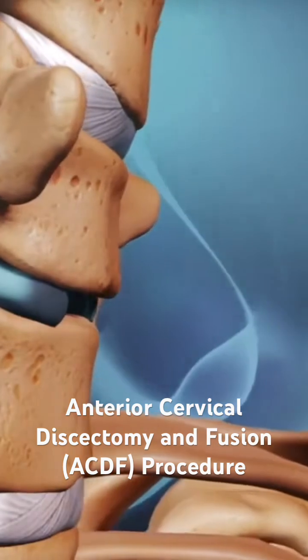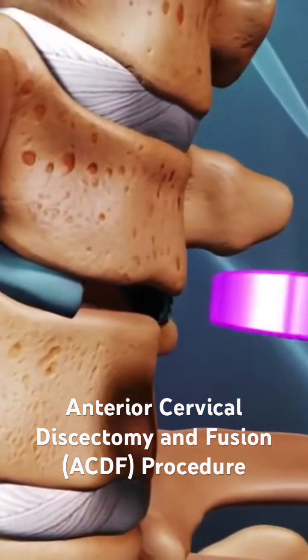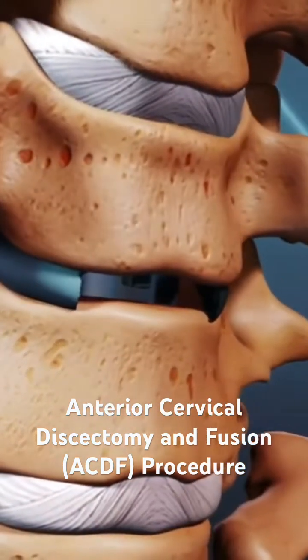Next, the anterior cervical fusion is performed, in which a bone graft or a cage is inserted into the space where the disc used to be.